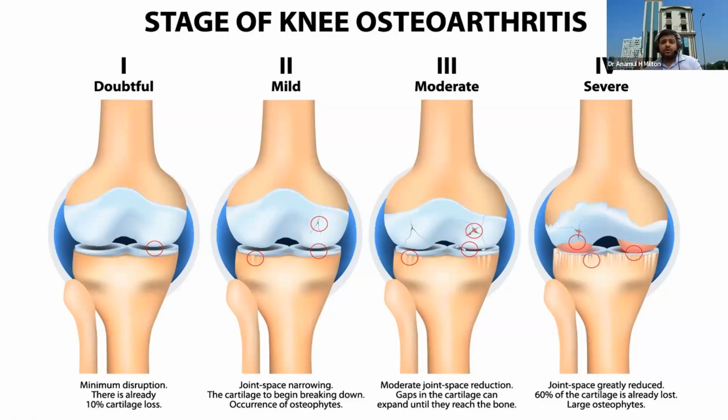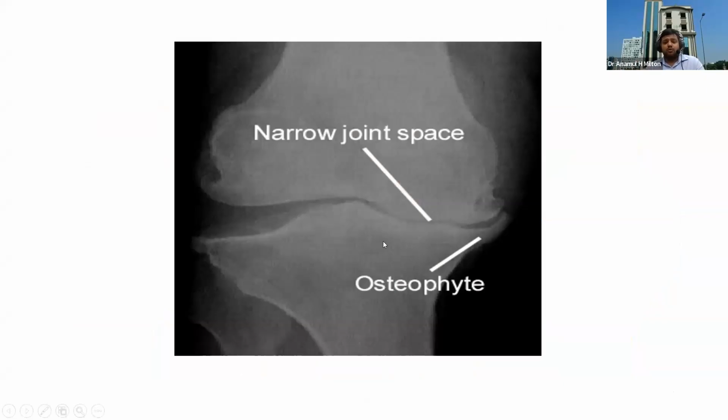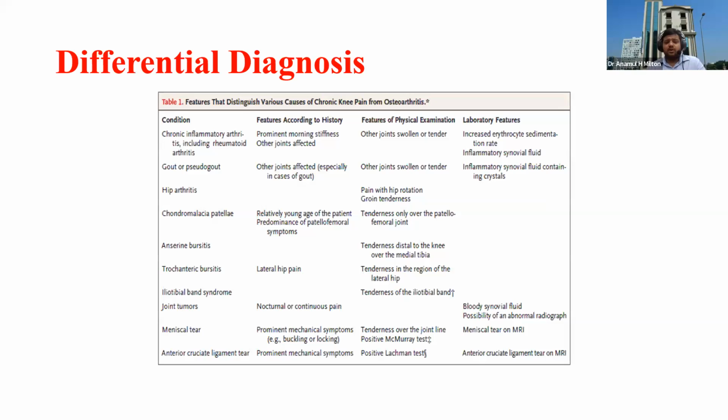One important part is that there is huge crepitation and sometimes bony outgrowth, meaning osteophytes. You can see large osteophytes and marked changes of the hyaline cartilage. So that is osteoarthritis grade 4. You can see a lot of narrowing of the joint and a lot of osteophytes here and here, and some hypo-dense areas in this X-ray too.